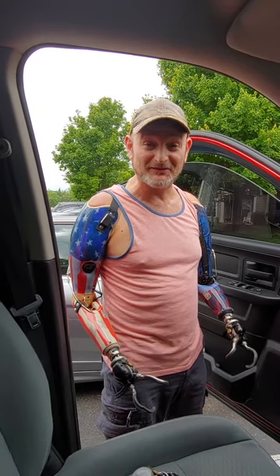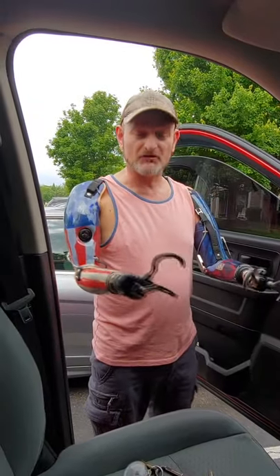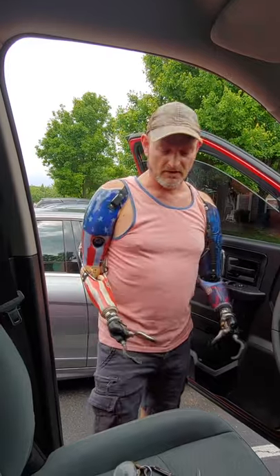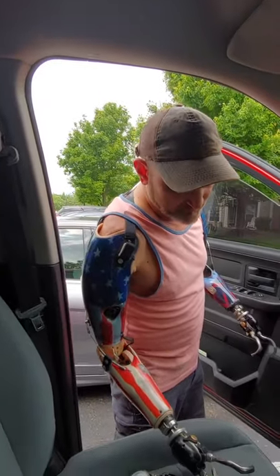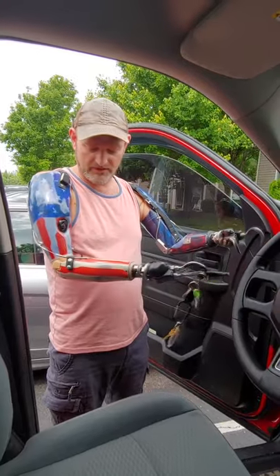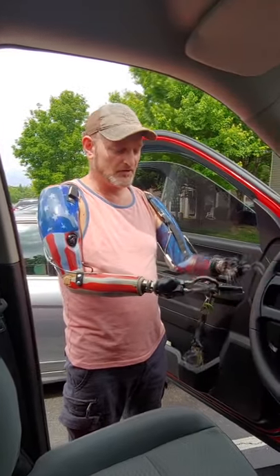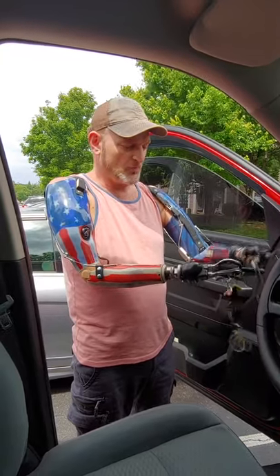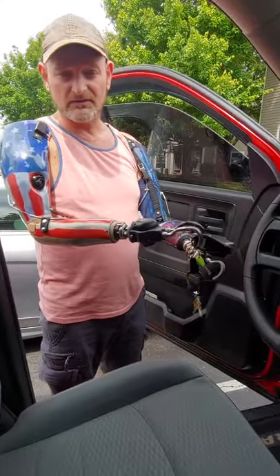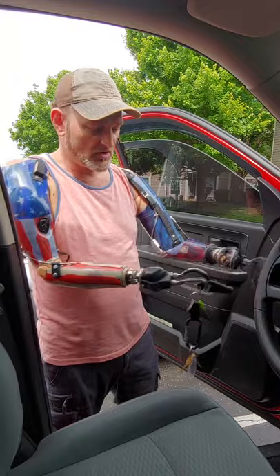Hey everybody, it's Billy P, the bilateral amputee. Today I'm going to show you how to drive my truck — I'm not going to drive it anywhere, just show you how I would do it. We'll start with the key. I'm going to use these prosthetics to do all this, using my bicep and tricep muscles to work these prosthetics — open and close. Open is tricep, close is bicep. Turn clockwise is tricep, counter clockwise is bicep.